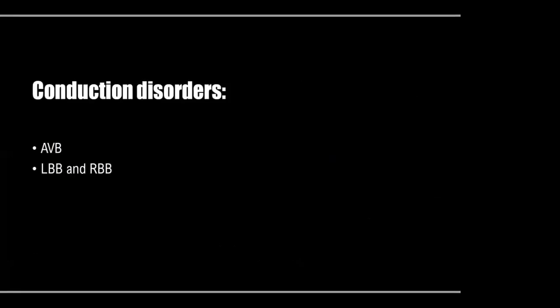Right, like I said before, today we are going to talk about conduction disorders, and I'm going to focus on the AV block, and we will also talk about the bundle blocks, the left bundle branch block and the right bundle branch block. Next.